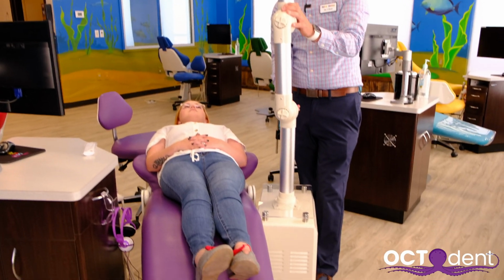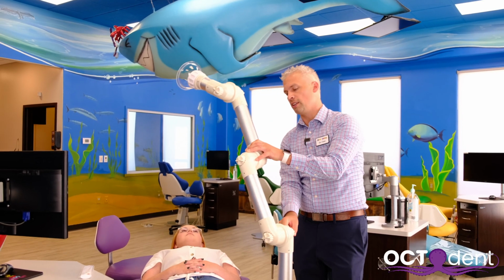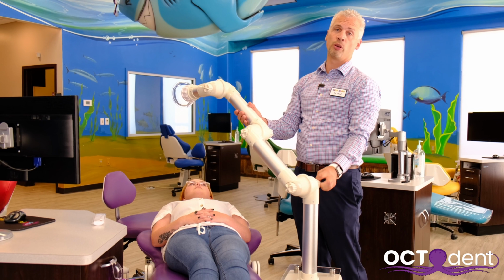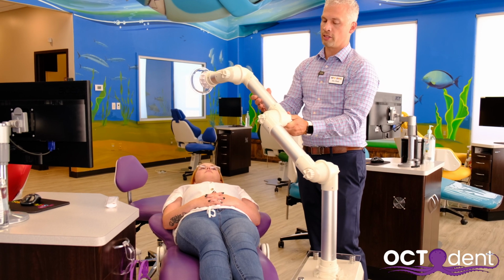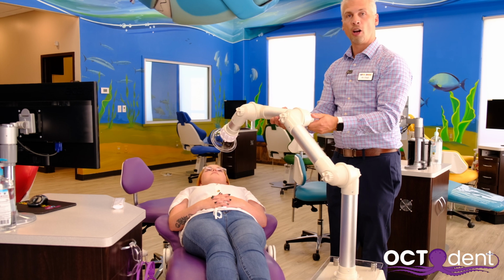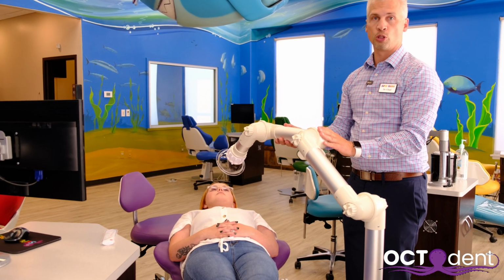Then the second thing we do is start leaning it over towards the patient, okay? And again, the patient isn't in the room yet, but we've got an idea of where we want this positioned. And lastly, this last portion right here just bends towards the patient. So really, I'm just moving two arms. If you notice, this arm, I didn't move at all. Just these two spots only.